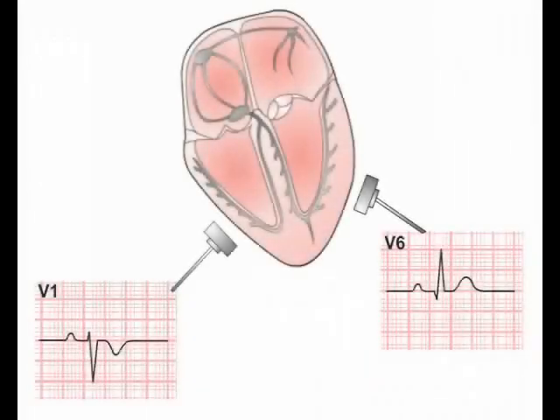How the cardiac depolarization and repolarization waves spread through the heart. Now we will go on to explain how these electrical events are analysed by the ECG leads to produce the waveforms of the ECG readout. Again, we will work with the 2D schematic of the heart as explained in video 1 of this section.